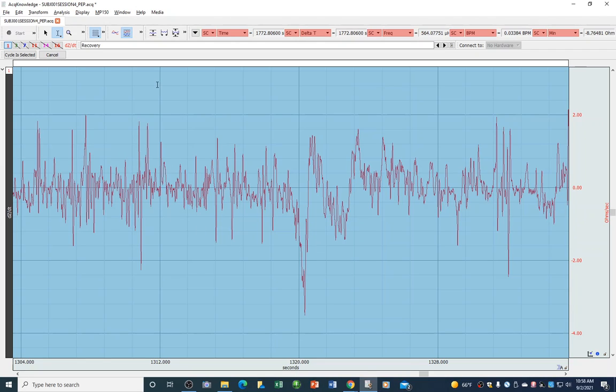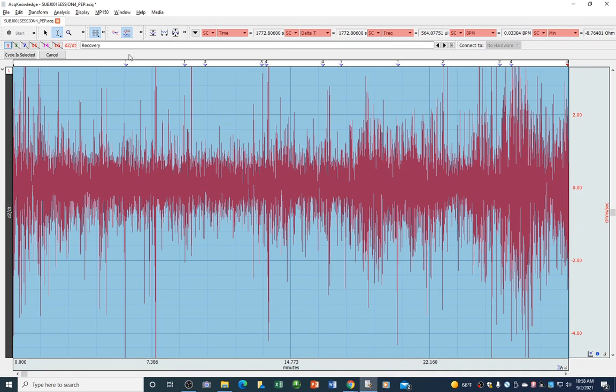So, tiny little window. These three buttons here are very useful. They put all of the data for the whole experiment into a window all at once. So if I click on this particular button here, it's going to show me the whole data set. It looks like it's the 30-minute data set. So I'm looking for the least noisy, least fuzzy place in here, and this right here seems to be the best I can get. It looks like a pretty fuzzy signal.